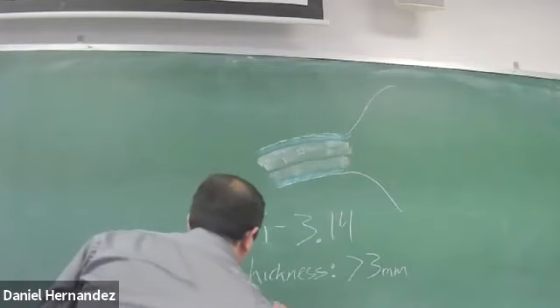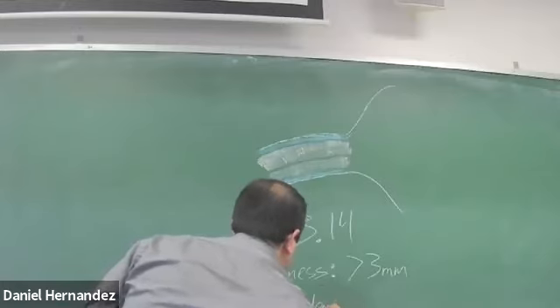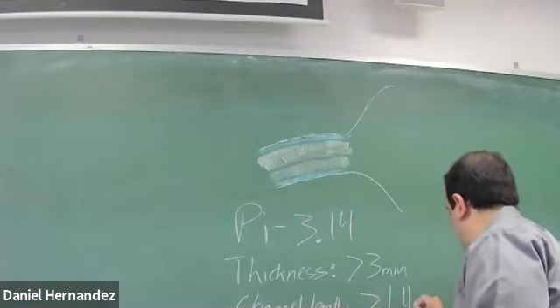And channel length is going to be greater than 1.4 centimeters.